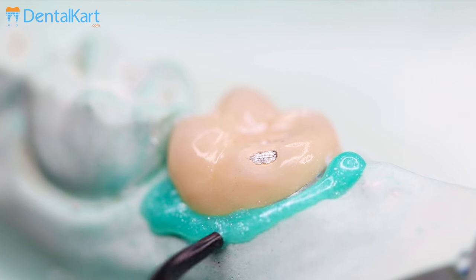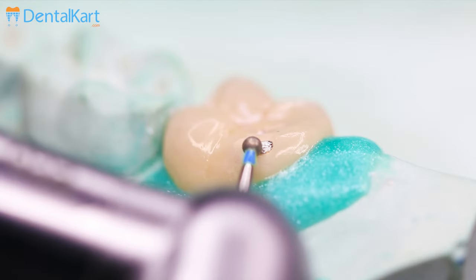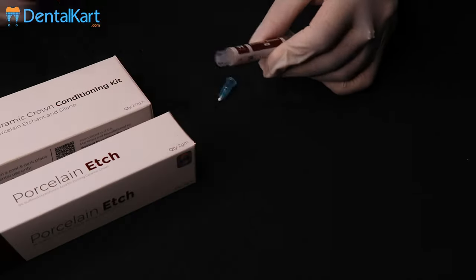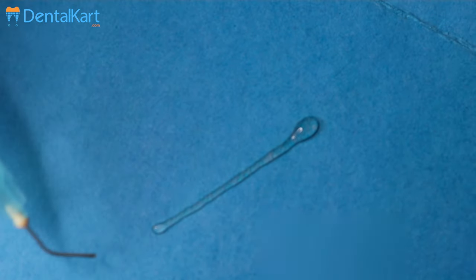Isolate the adjacent tissues with a rubber dam or gingival barrier. Slightly abrade the porcelain surface or exposed metal surface with a high-speed diamond bur or micro air abrasion. Then attach the applicating tip to the Walden Porcelain Etch tube and verify flow and consistency before applying.